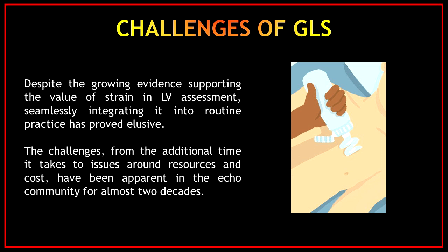Everything comes with a challenge. So what are the challenges of global longitudinal strain? Despite the growing evidence supporting the value of strain in left ventricular assessment, seamlessly integrating it into routine practice has proved elusive. The challenges, from the additional time it takes to issues around resources and cost, have been apparent in the echo community for almost 2 decades.